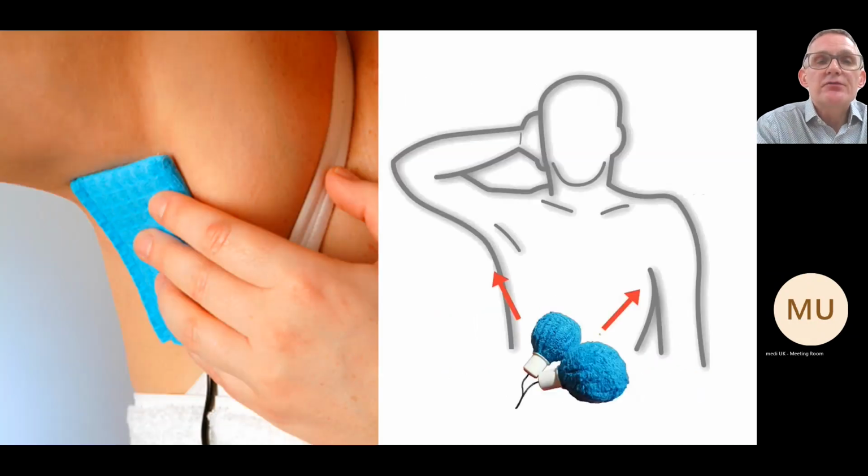For the underarms, you have special electrodes, which are sponge covered and have to be very closely adapted to the skin, and I'll show you that in a moment. So most hospital clinics have these carbon electrodes covered by sponges. There are ball-shaped electrodes which can be provided, but those are single patient use, so they tend not to be used very often in hospitals.